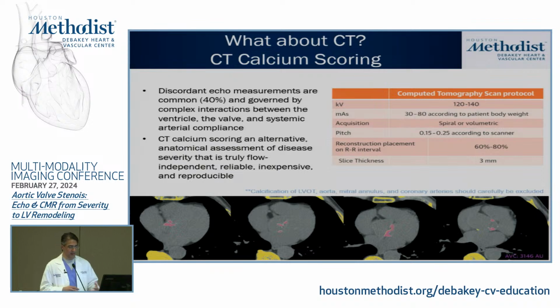So now I'm going to transition to the next phase of my talk, which is looking at some of the other advanced imaging modalities. What about CT? We've talked a lot about MRI, but we heard some from Dr. Cherubulu. What about it?